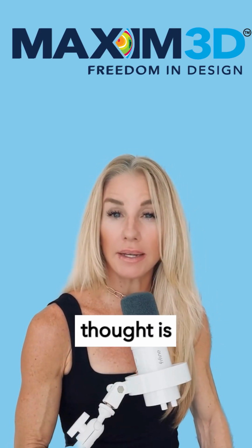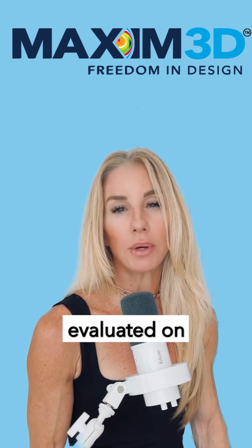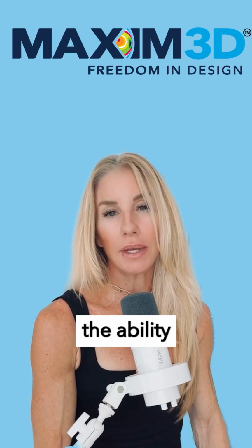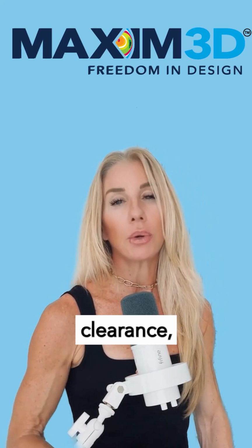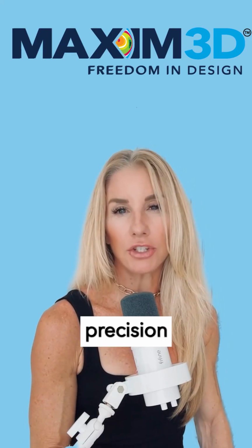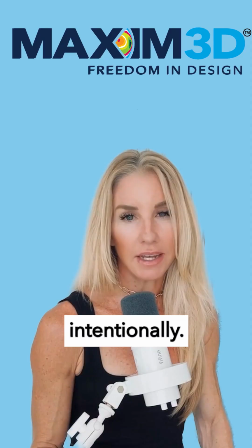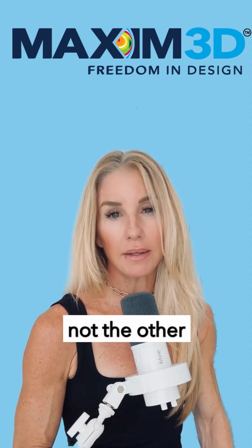Our final thought is, each zone, meaning central, limbal, and landing, should be evaluated on its own. With the Maxim 3D platform, you have the ability to adjust each zone independently. That means you can optimize central clearance, refine limbal sag, or modify edge alignment without disrupting the rest of the design. This freedom gives you control, precision, and efficiency. No overhauls, no guesswork. Assess intentionally, adjust confidently, and let the lens conform to the eye, not the other way around.